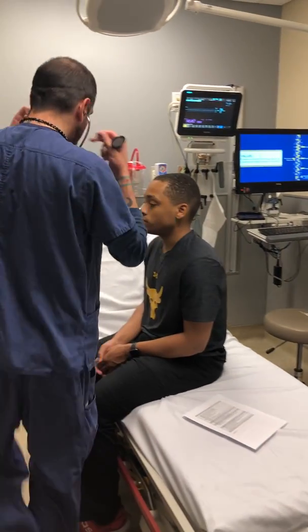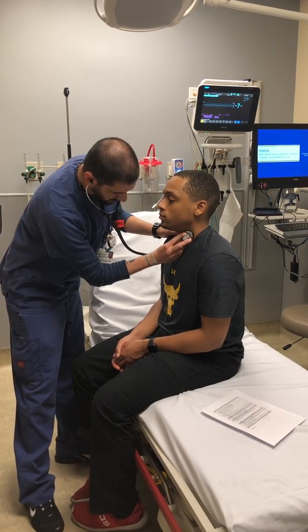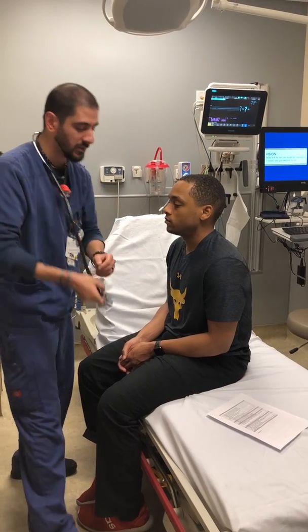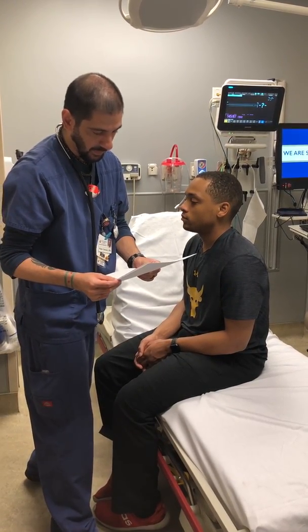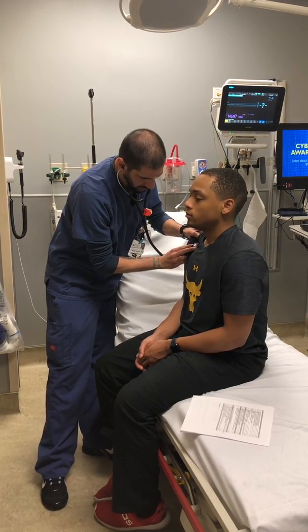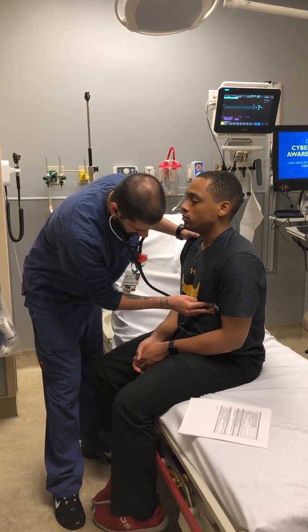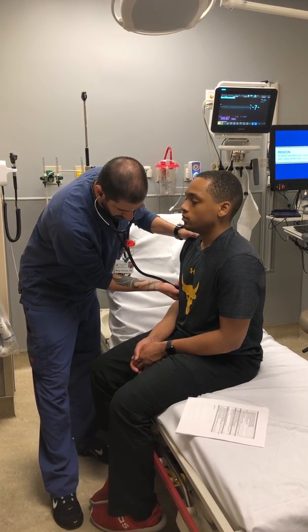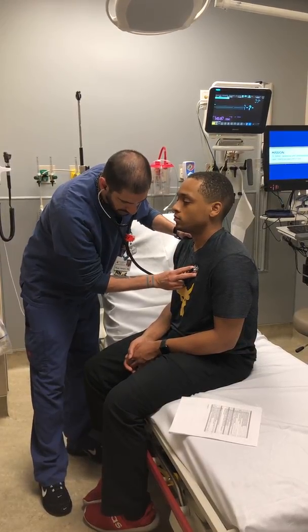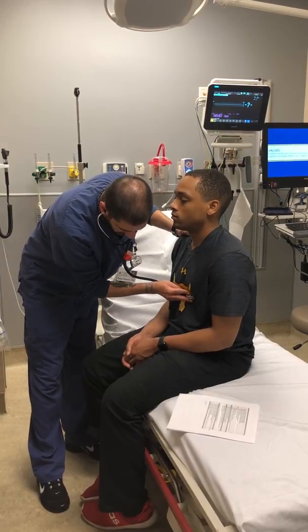We're going to auscultate the carotids for bruits. There does not sound to be any type of occlusion there. And so now breath sounds in the anterior chest. And now to listen to heart sounds, the aortic, pulmonic, tricuspid, and mitral valve.